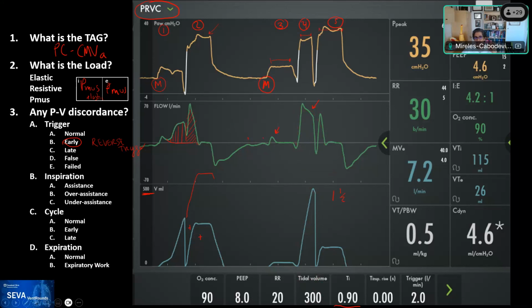It will cycle off the breath as a safety mechanism, thinking that the tidal volume has overshot 1.5 times your tidal volume. Rob? And as far as I know, this isn't documented in the manual anywhere. At least I haven't been able to find it.